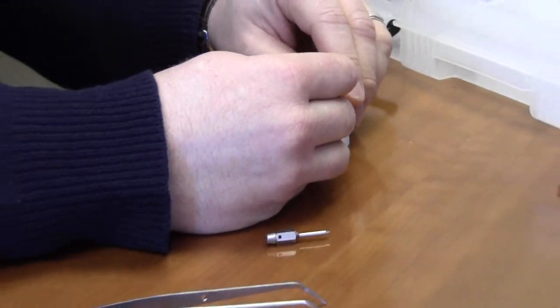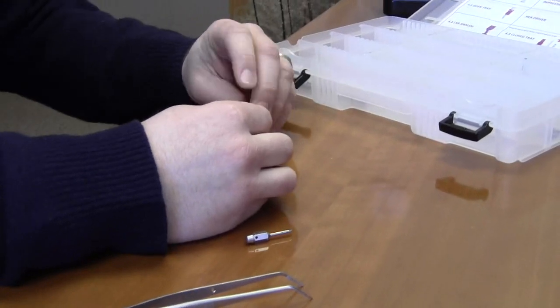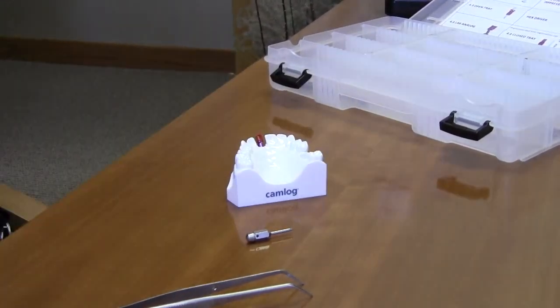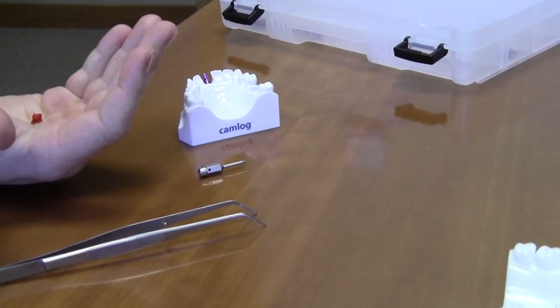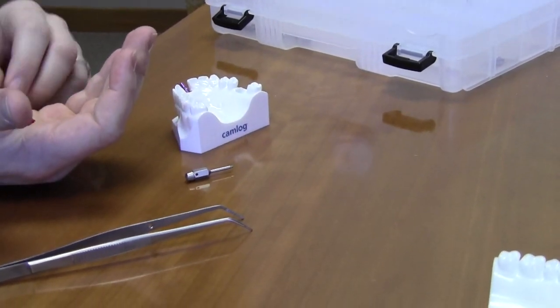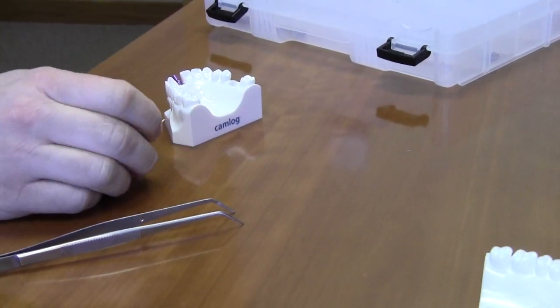The cap just snaps on top — there we go. You can feel that kind of lock into place too; there's a rotational fit to it. It's locked into place. You take the impression, and the cap stays in the impression. That's what you send off to the lab, along with the impression post and the screw as well. So that's the impression taken.